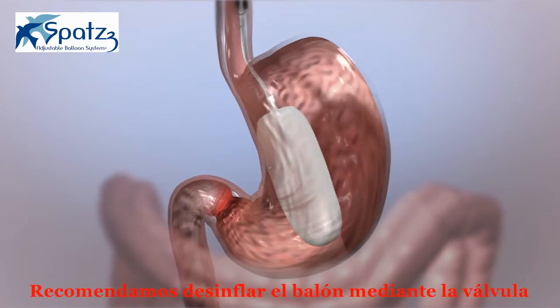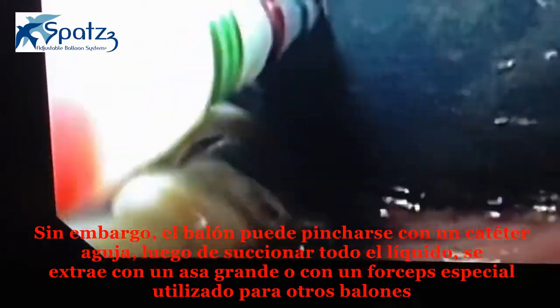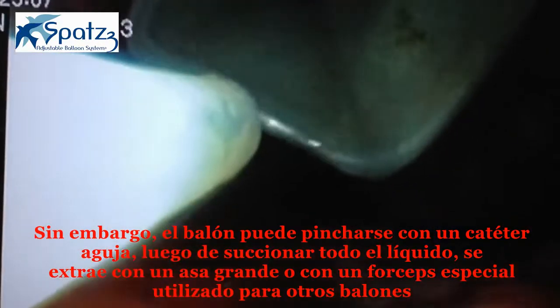We recommend deflating the balloon using the valve. However, the balloon may be deflated with a gastric balloon needle catheter, followed by extraction with a large snare or balloon-specific grasping forceps, as with other balloons.